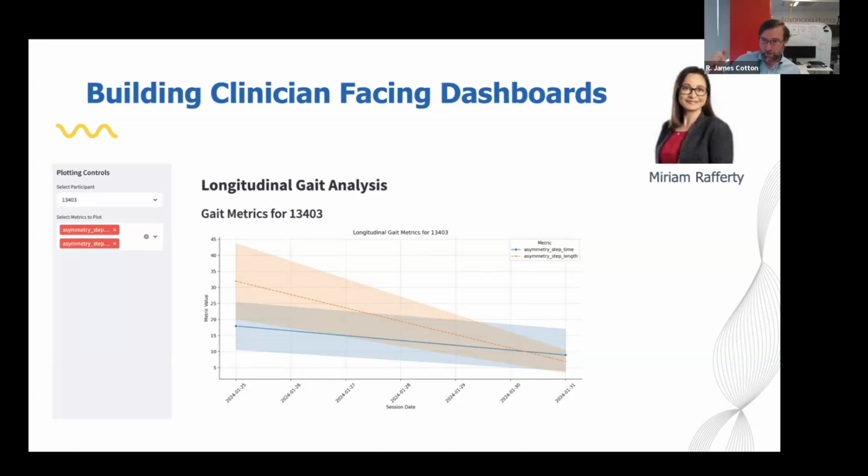But you'll see in the workbook we're about to do, hopefully we can go from a video to results in under 10 minutes. The other thing is when we use this system, again, tied into our big infrastructure, we'll do the bi-level optimization. So we'll fit all the trials as one optimization approach to make sure that a person has a single skeleton during that, which is not going to be in the notebook. And so, yeah, we can get it done pretty quickly.